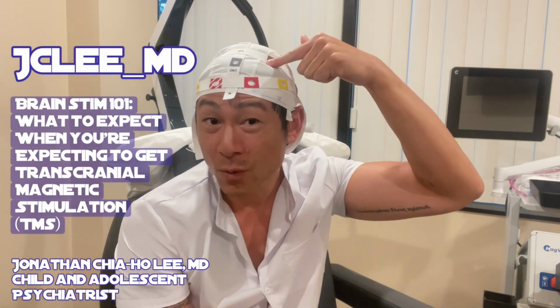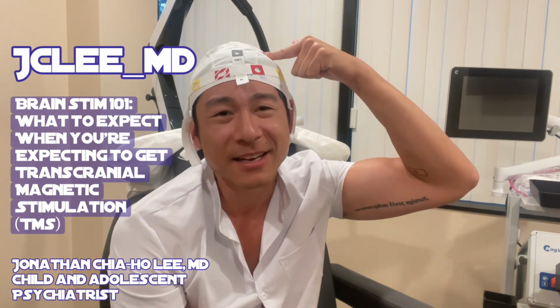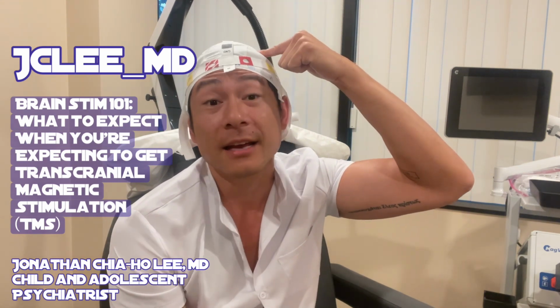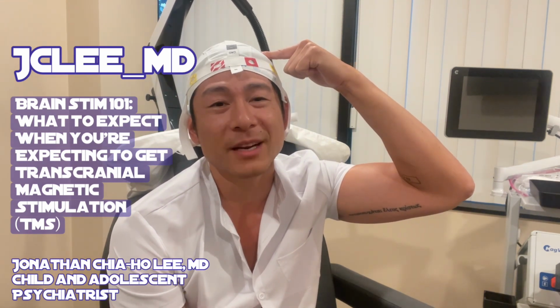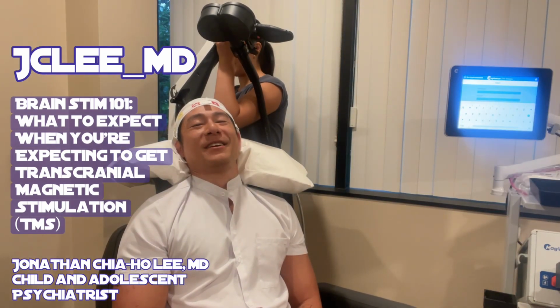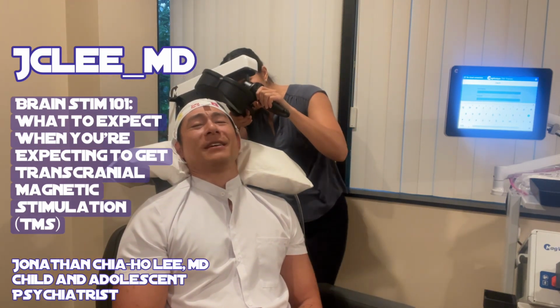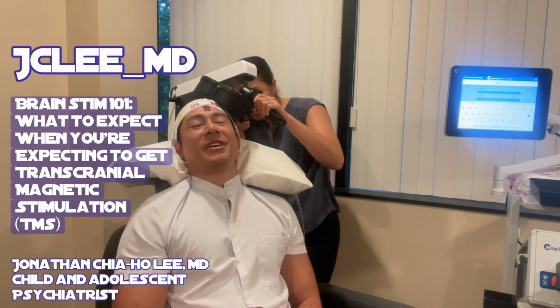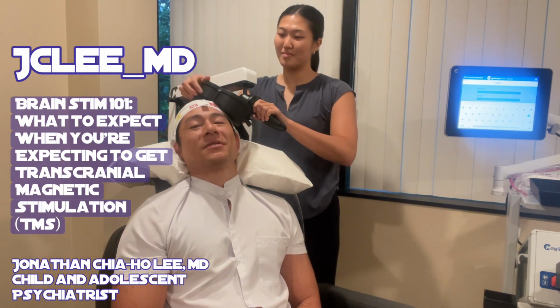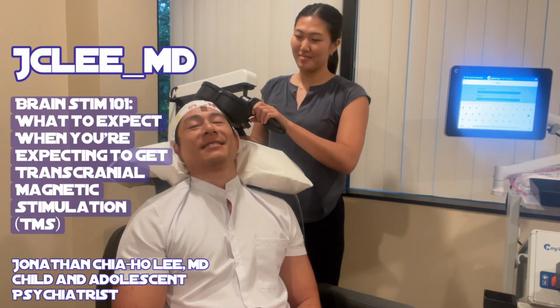And this is the area where we're trying to aim with the TMS coil to really amplify that executive functioning: thinking, planning, memory, attention, concentration, all of that good stuff. And obviously in this case, emotion regulation. As Erin's lowering the magnet right now, she's trying to find that area where the center of the coil, in between the two loops of that infinity or figure-8 shape, opposes F3 or the left dorsolateral prefrontal cortex so that it's perfectly tangential with the scalp.